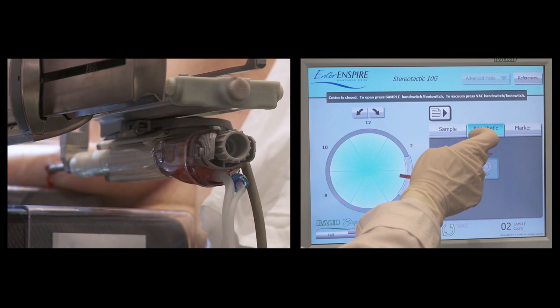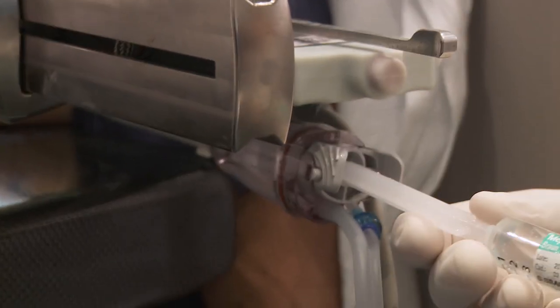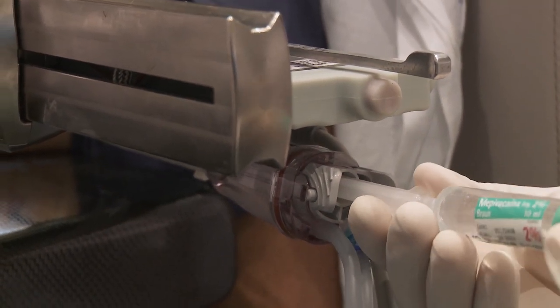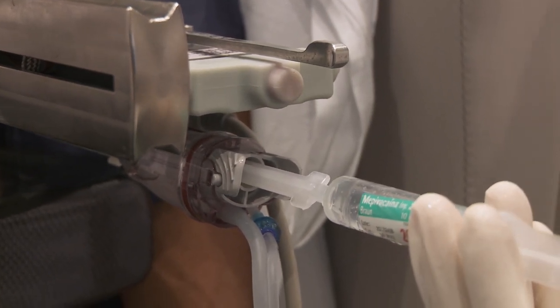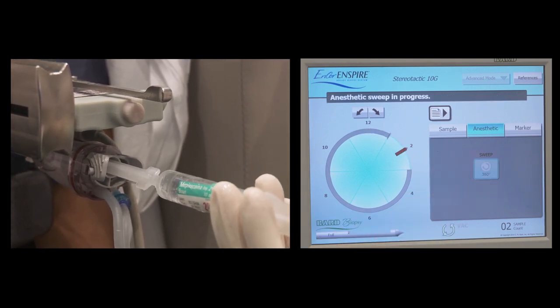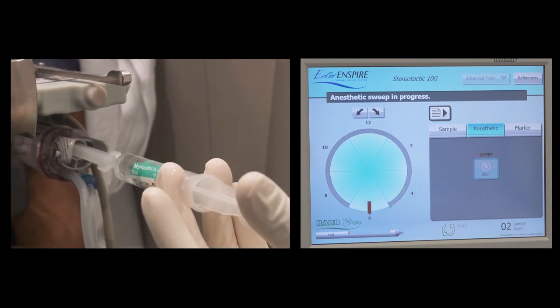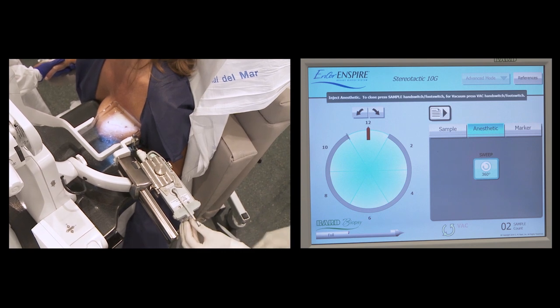Select the anesthetic tab, remove the basket rear cover, connect the anesthesia syringe with the anesthetic adapter, fill it with anesthesia to avoid entry of air in the breast, and connect to the probe internal sheath. Press the 360-degree button so that the anesthesia is spread equally. When done, remove the anesthetic adapter and put the basket rear cover back in place.